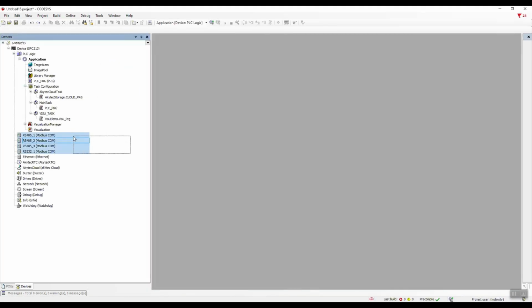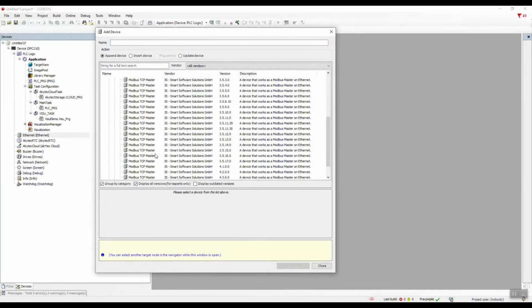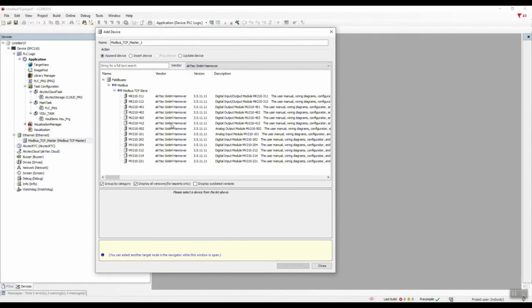Next, delete the unnecessary device in our project using the delete command. Add the Modbus TCP master from CODESYS component to the Ethernet device. And then, you should include the specific polling data templates for the various modules from akYtec into the existing system.